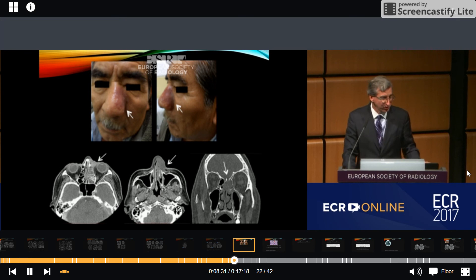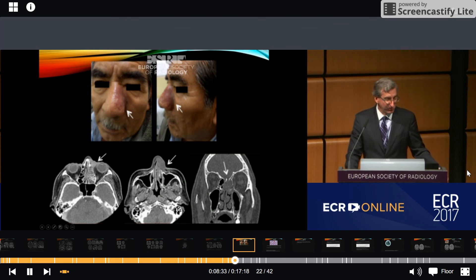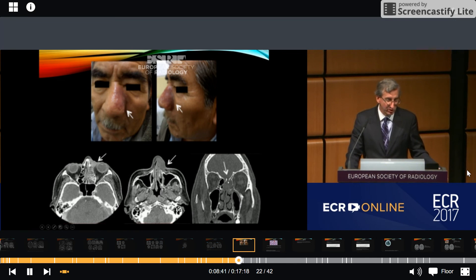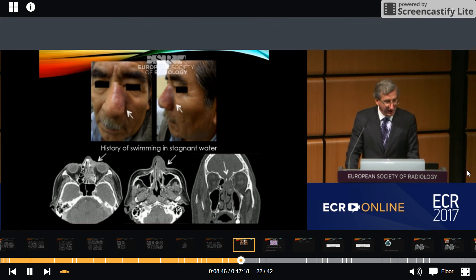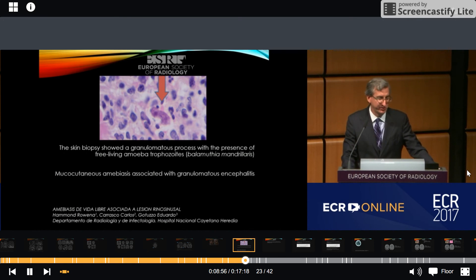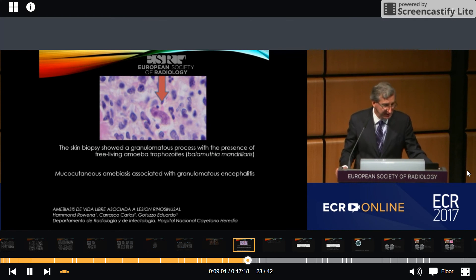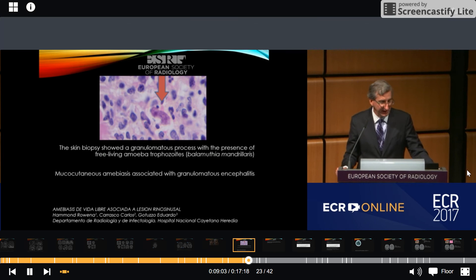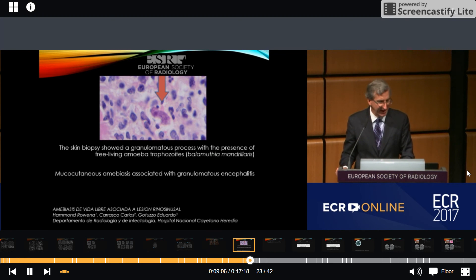The CT shows compromise of the ethmoid sinus, the orbits, and the soft tissue surrounding the nose. In the coronal image, we can see extension of the lesion to the left frontal lobe. He had a history of swimming in sand and water. The skin biopsy showed a granulomatous process with the presence of free-living amoeba trophozoites — it was Balamuthia mandrillaris. The final diagnosis in this case was mucocutaneous amebiasis associated with granulomatous encephalitis.